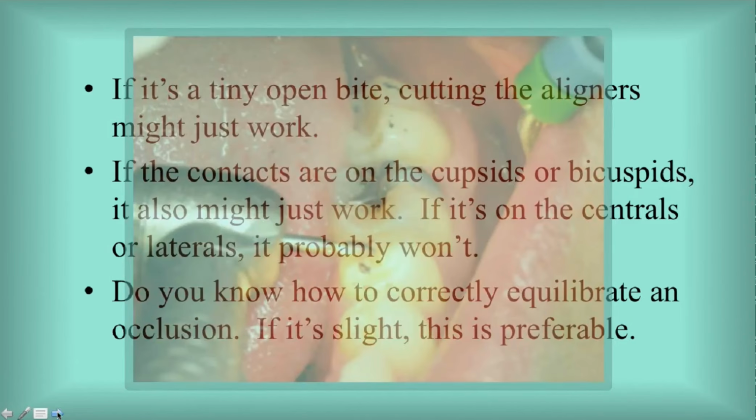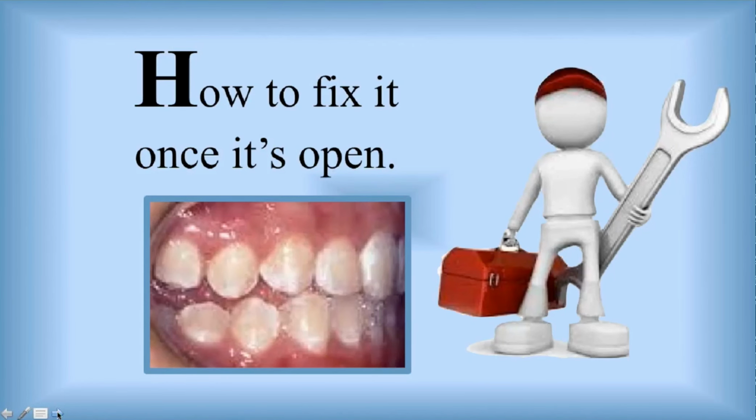Okay, so let's go to the hard part. This is the part that we like the least, is how to fix it once it's open. Because this takes a little bit more effort than you're used to because there's not a quick fix if you have a significant posterior open bite. It requires reworking the case, and I would like to remind you or warn you right now, you cannot fix this simply by sending in for refinement.